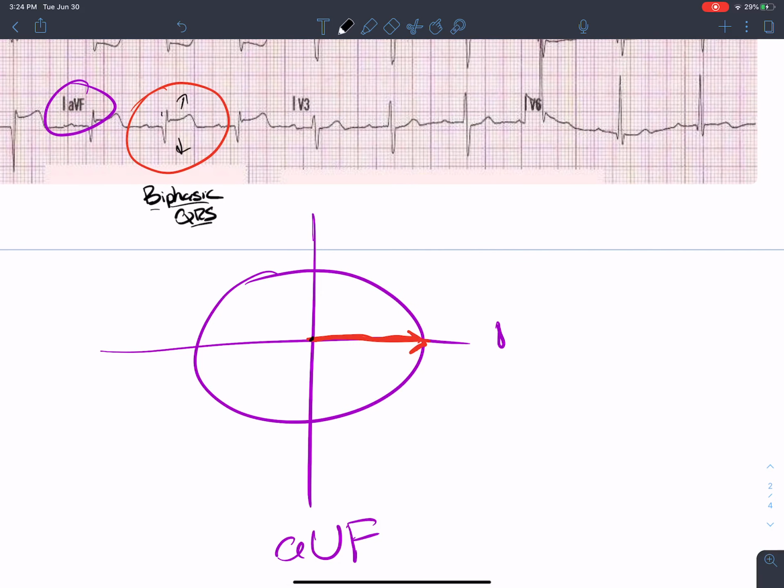So if we had a positive AVF, it was going all up, it would be traveling in this direction. If we had a negative AVF, it would be traveling in this direction. But we don't. We're somewhere in the middle. We're calling it equal up, equal down. So there's nothing. We get a non-contributory dot. Doesn't make a difference. Thanks a lot, dot.